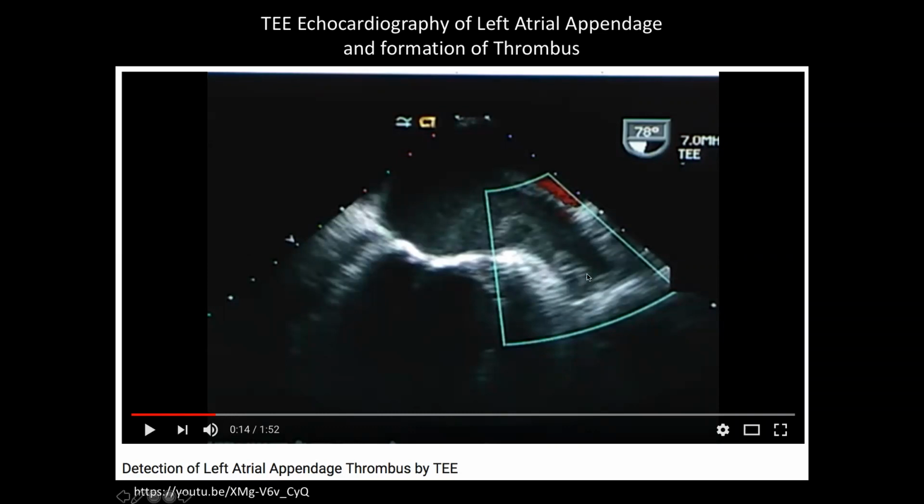You do not want to do that if that thing is in there, right? Because this starts contracting again, and it's going to squirt it out. So this is the downstream cost of a false negative. A false negative in this situation is I say, nope, it's negative, there's no thrombus. False negative means there actually is a thrombus. And I make that call, they go defibrillate, and this squirts out and you get a stroke, right?